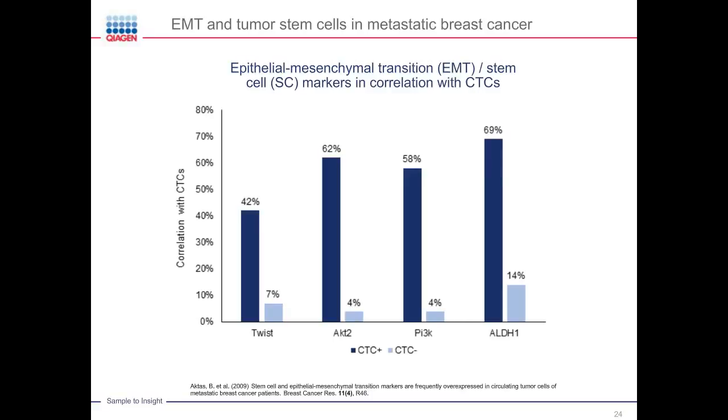And what we see here, what really happens is that if CTCs are in the circulation, I would say based on these results, nearly all of them, at least 80% of them, taking everything together, are either EMT-like or tumor stem cell-like. That means, in other words, that a number of these low-frequency cells that already have the stemness capability in the tissue is really the phenotype of cells that leaves the tumor, enters the circulation, and is the seat of metastasization, at least based on these results here.